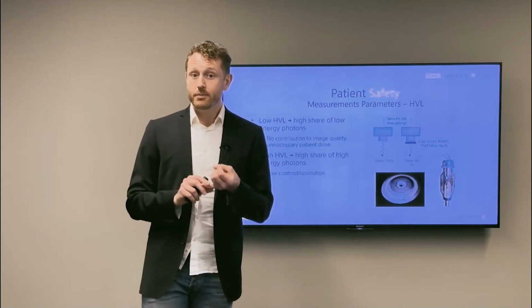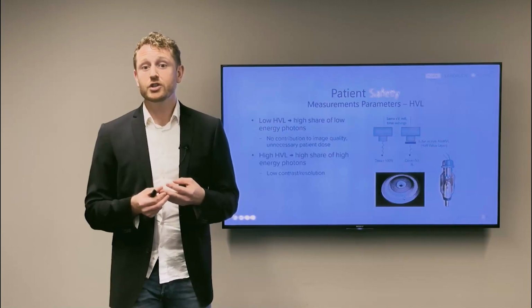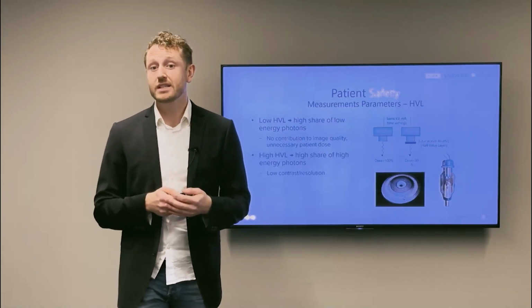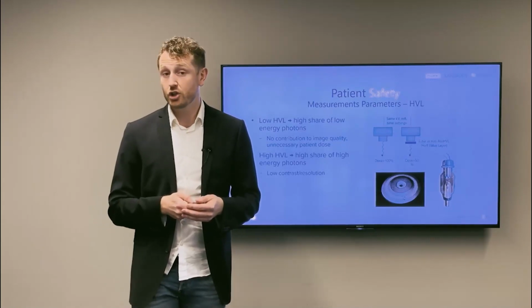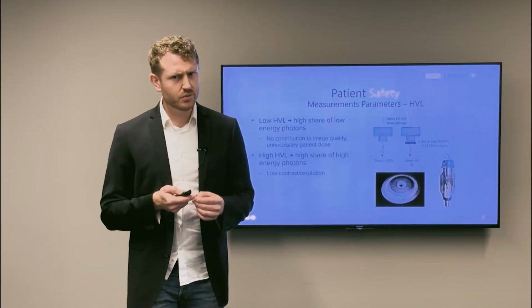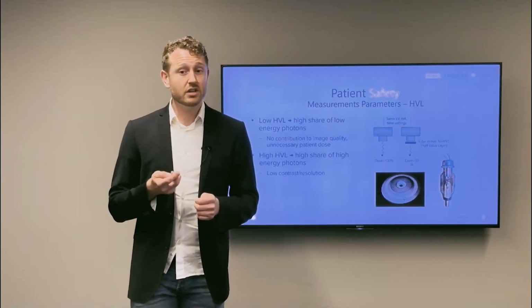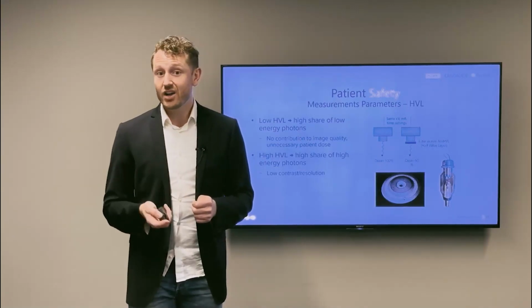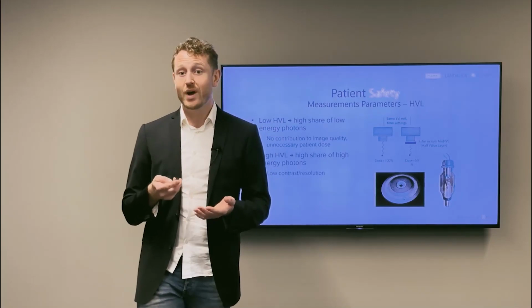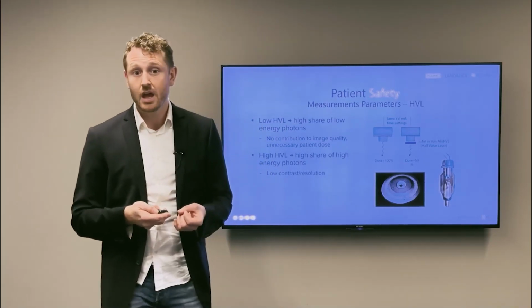There are mainly two ways of measuring HVL. The manual way is to first measure dose, then add filters until the measured dose is 50% of the original dose. These types of measurements are extremely hard to do and uncertainty is high. After the entrance of solid-state sensors instead of ion chambers, one has been able to get enough information out of the exposure so HVL can be calculated directly from a single exposure.